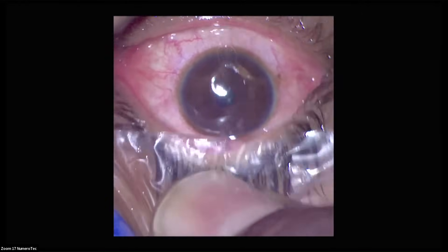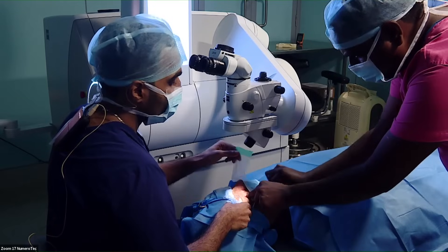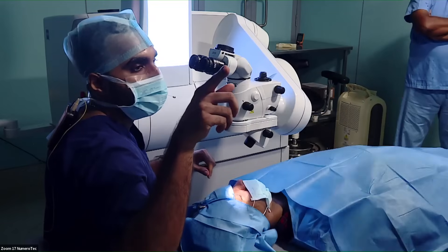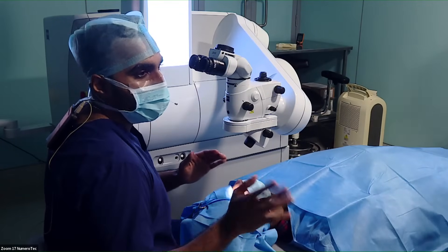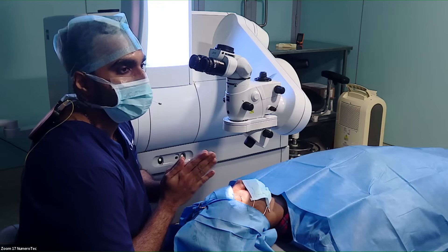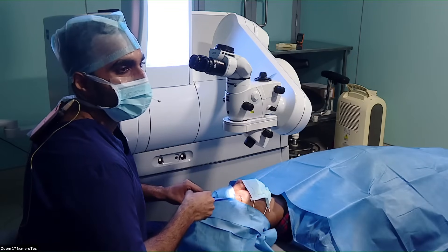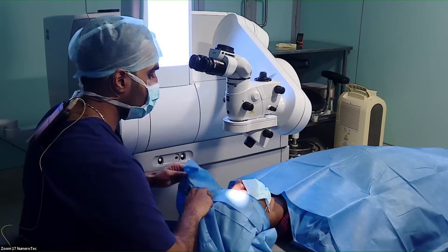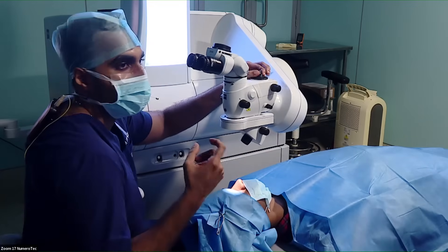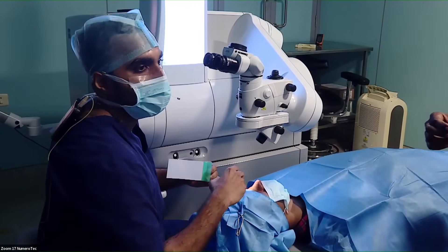When does the cyclotorsion compensation happen during the procedure? When docking occurs, if the patient has a high cylinder and you've marked the limbus at zero and 180 preoperatively, you can rotate the joystick and align the reticules along the zero-180 degree mark to compensate for cyclotorsion. We've been doing SMILE from 2014, treating cylinders as high as minus four or five, and have noticed excellent results even without cyclotorsion compensation. But since this machine has it, I go ahead and use it for high cylinder patients. In a couple of months, they say they're coming with automated software that will work in cohesion with the IOL Master, so all of that will happen automatically.